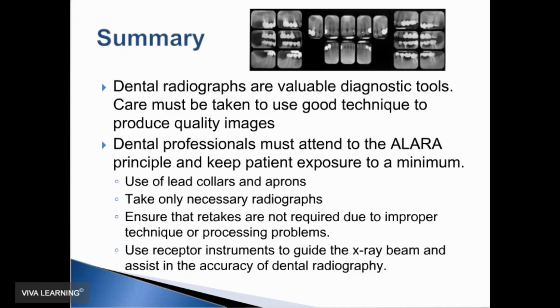So as we're coming to a close here for the PowerPoint presentation, dental radiographs are critical and important diagnostic tools in dentistry. In order for them to be valuable, for the dentist to be able to make proper judgments about patient care, they must be diagnostic and of good quality.